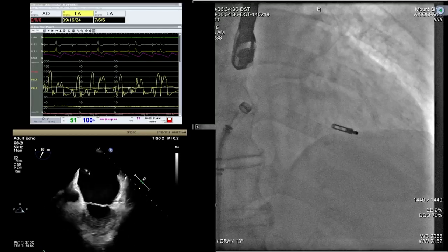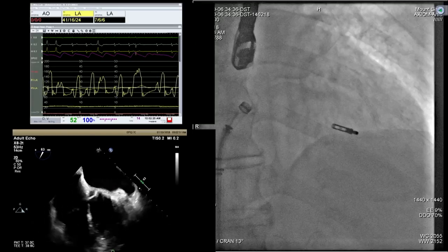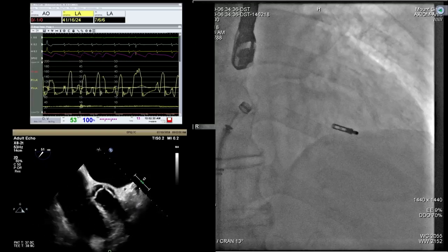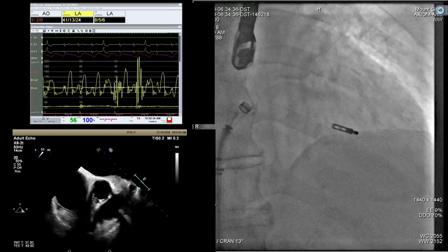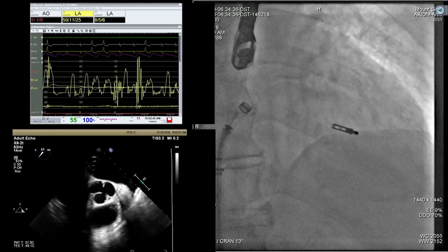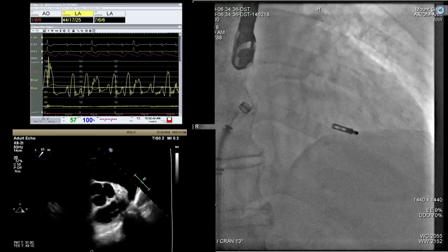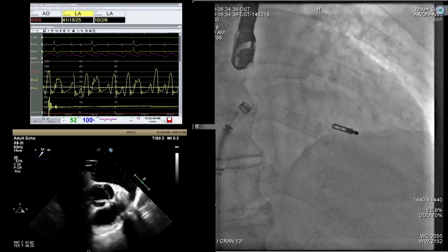So basically in the past, and particularly in the Everest trial, people were happy with this. Looking okay, we left moderate, and it turns out that leaving 2+ MR was associated with events at follow-up. That's why we are becoming more aggressive now, putting more clips. And so now the question is, when you're putting a second clip, are you going to put an XT or NT? XT. Still XT. It's a big annulus. And no gradient.